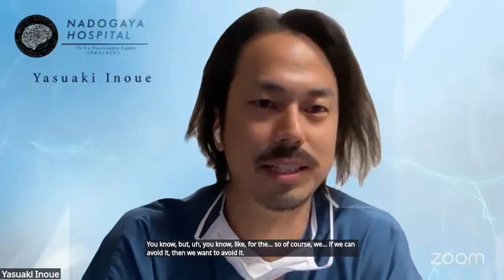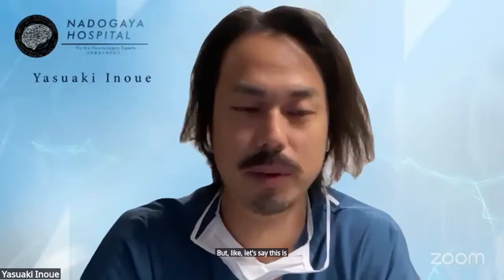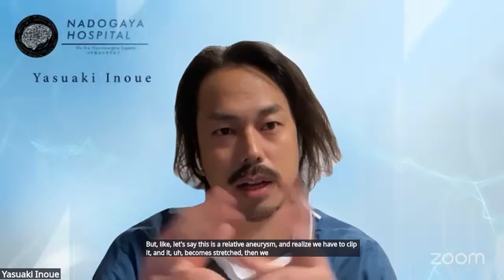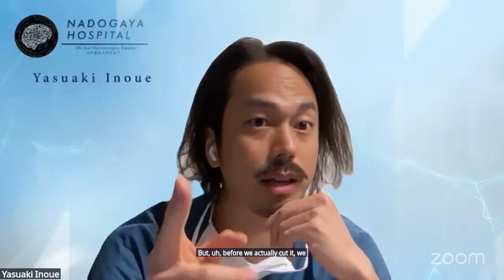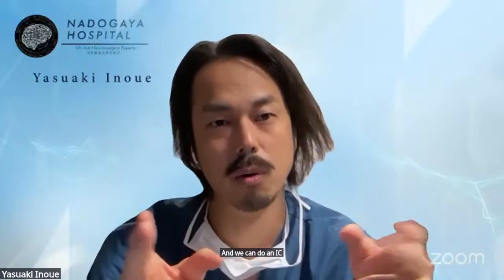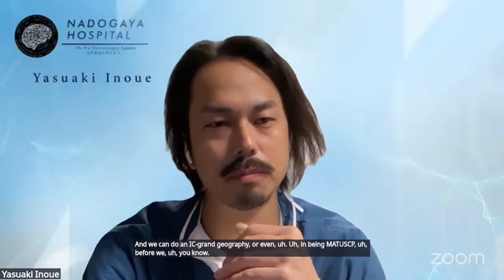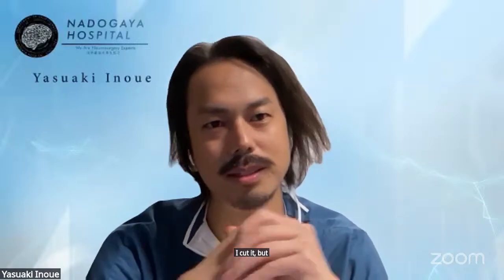But let's say this is a ruptured basilar-top aneurysm and we have to clip it, and the PCOM is stretched, then we have to cut it. Before we cut it, we can apply a very tiny temporary clip, and then do ICG angiography or even MEP monitoring before we cut it. But regardless, in some cases we have to cut it.